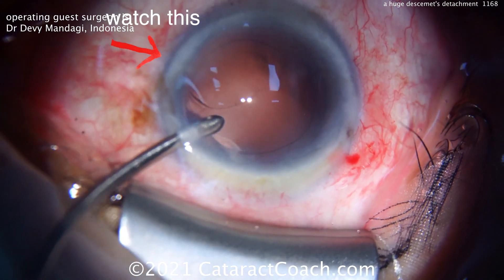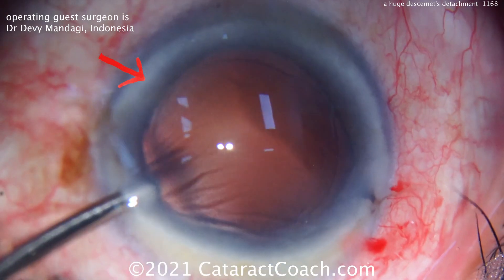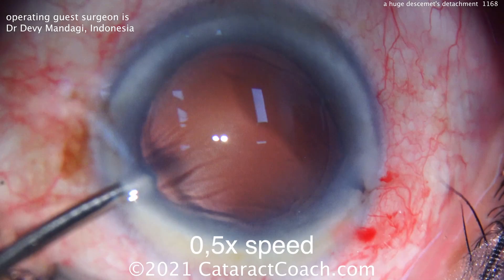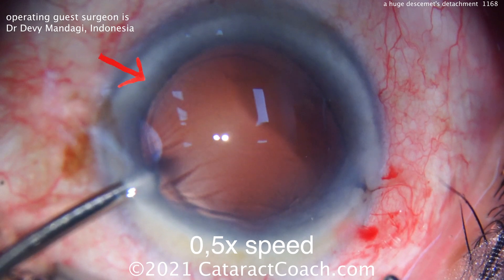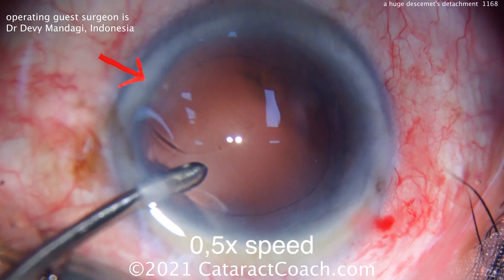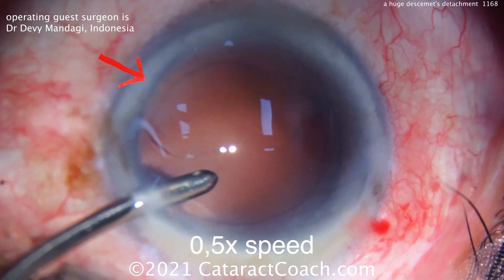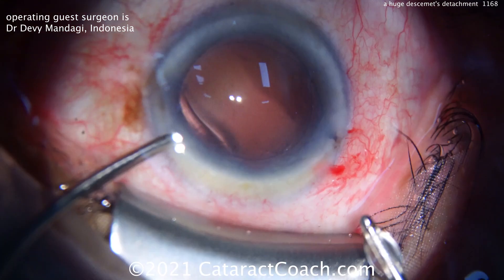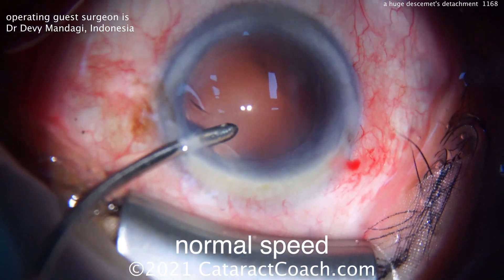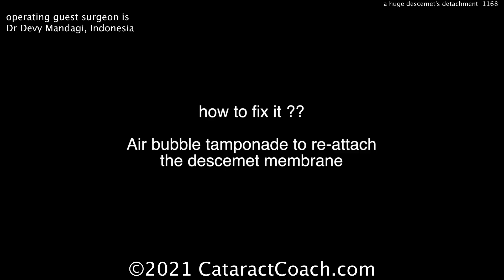Infusion from the bimanual goes in the eye and immediately pulls off Descemet's, because the port was just facing in the direction that allowed it to get under Descemet's and the entire layer starts to peel off. Wow. So this patient is in the aphakic state. Watch again — cortex removal, putting the infusion in, and just like that Descemet's peels off.